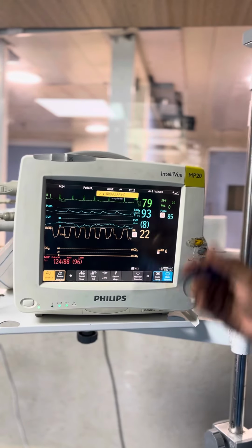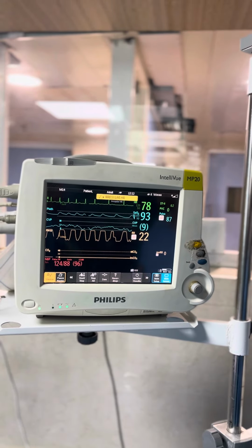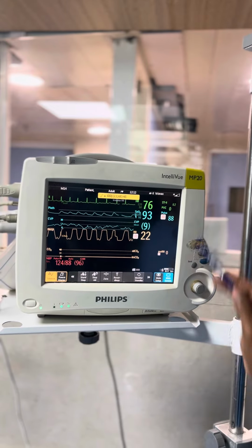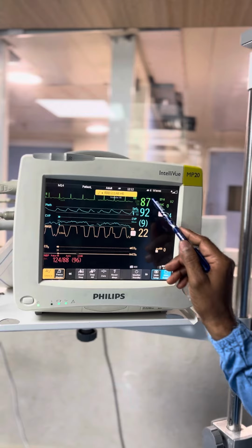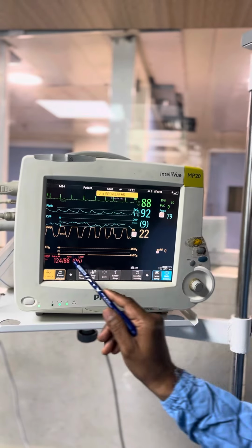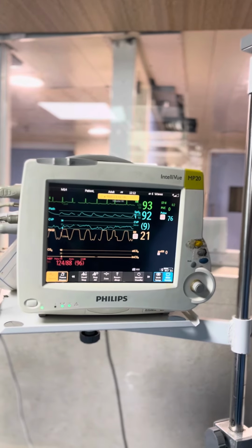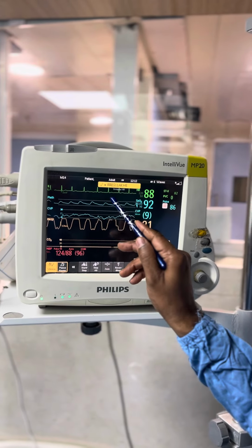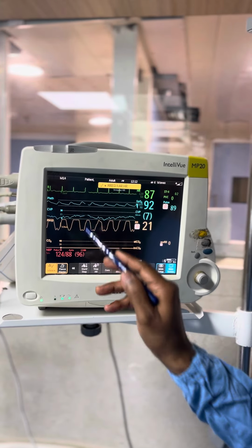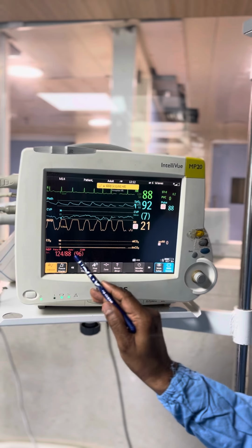If you go back to the previous video sessions, in the classes we talked about the monitor. We can monitor 7 parameters in this. Here we are able to see 1, 2, 3, 4, 5 and 6. So today what we have understood is atrial fibrillation. This patient is having atrial fibrillation but a stable rhythm and a stable blood pressure.